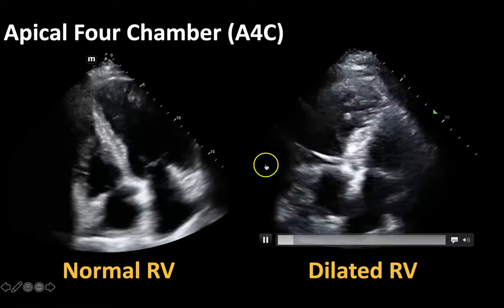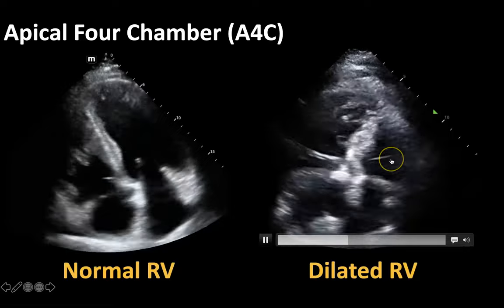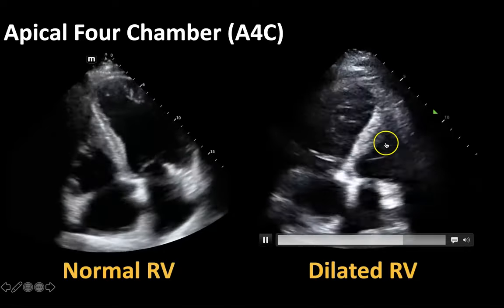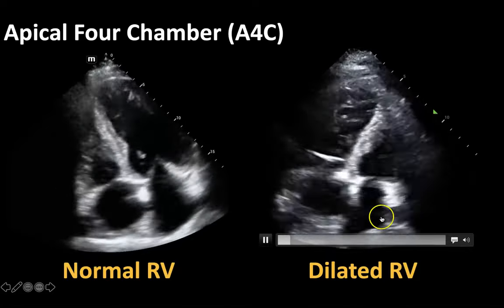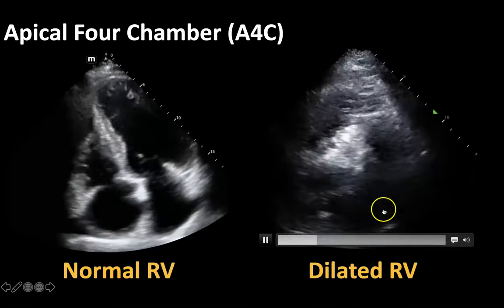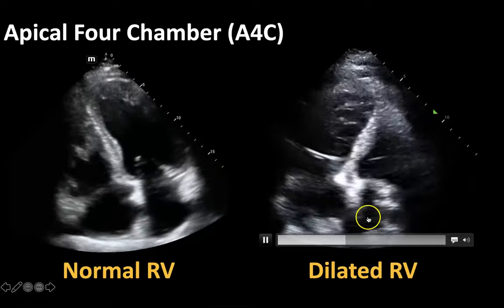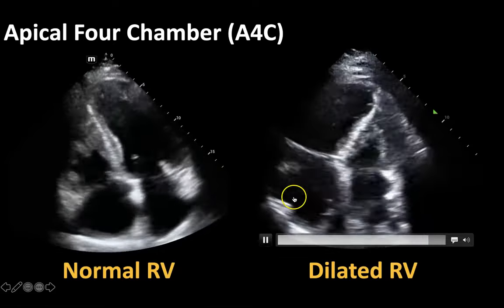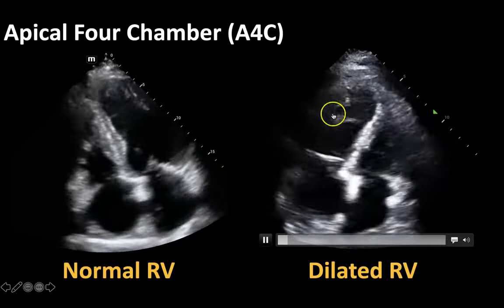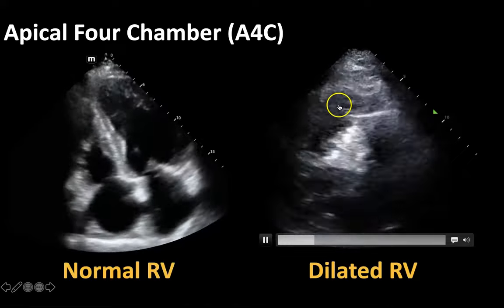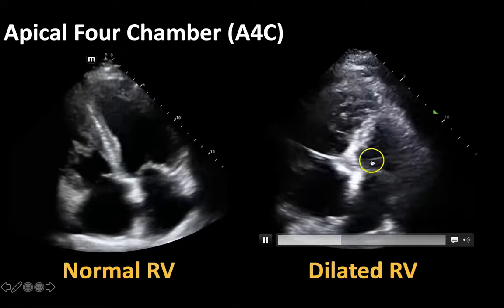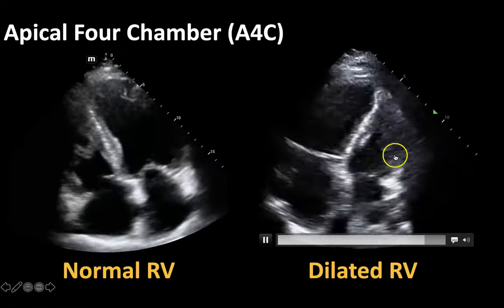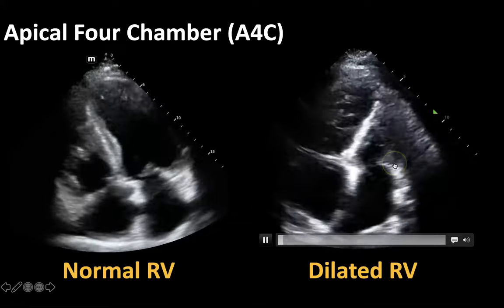This is in contrast to the heart on the right side of the screen. Again this is your apical four chamber view — not the greatest window, but you can still appreciate here that this is your left atrium, your left ventricle, your right atrium, your right ventricle. When you see the free walls coming in and out of plane, you can assess for the diameter here.